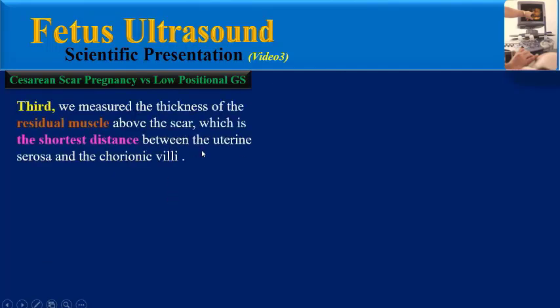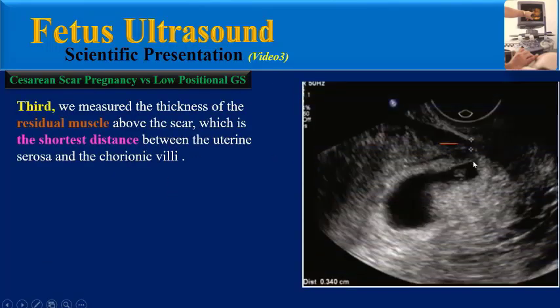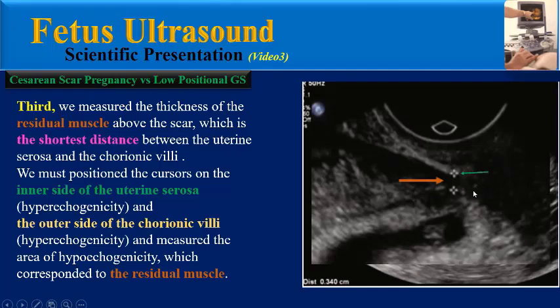In the third step, we measure the thickness of the residual muscle above the scar, which is the shortest distance between the uterine serosa and the chorionic villi. We must position the calipers on the inner side of the uterine serosa, which is hyperechoic, and the outer side of the chorionic villi, which is also hyperechoic. We then measure this area between the two hyperechoic lines, which is the residual muscle.